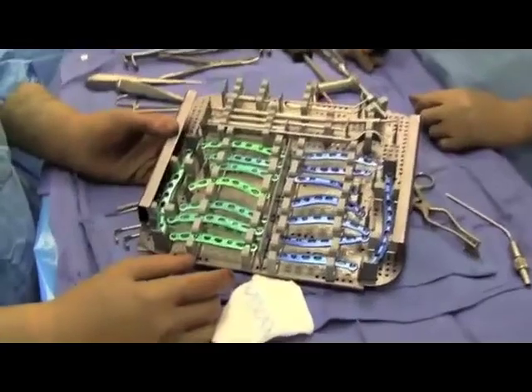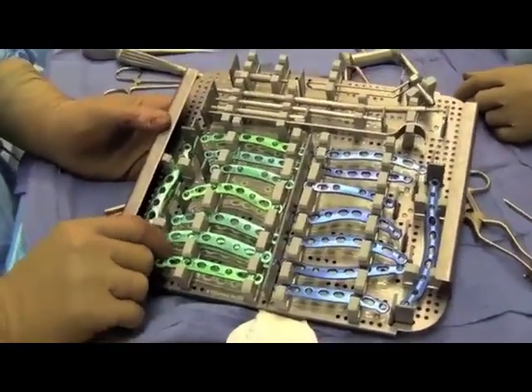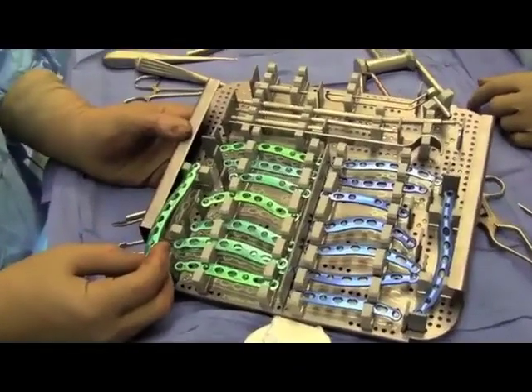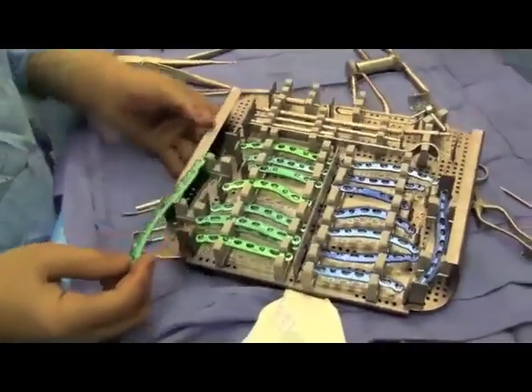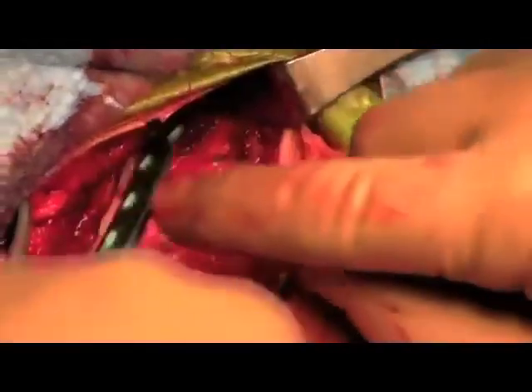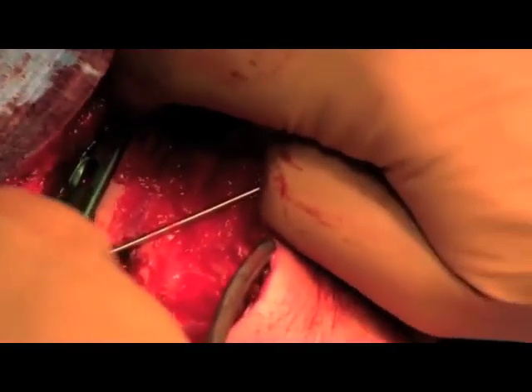This system, as most, has both superior and antero-inferior plates available for use in these fractures. A superior plate with the appropriate contour is chosen and positioned with at least 3 screw holes on either side of the fracture.